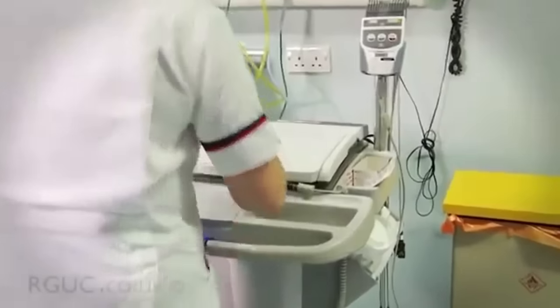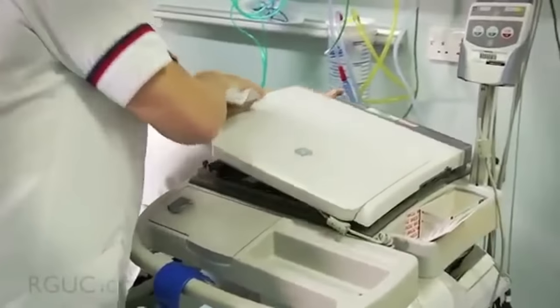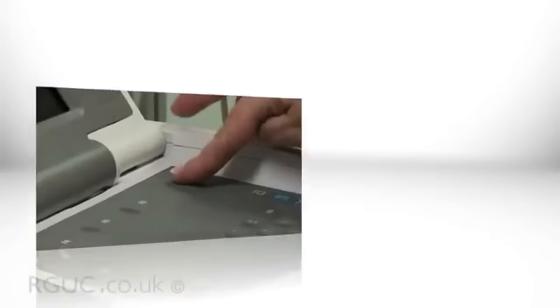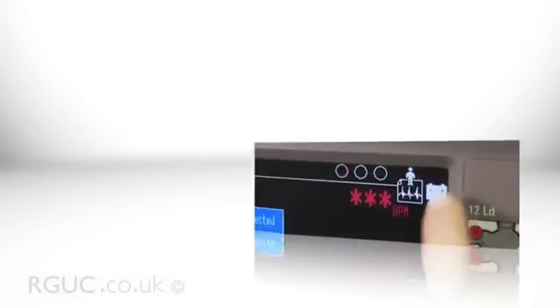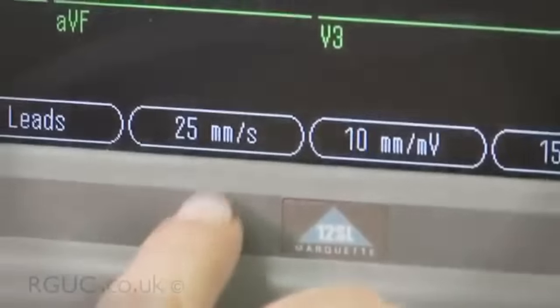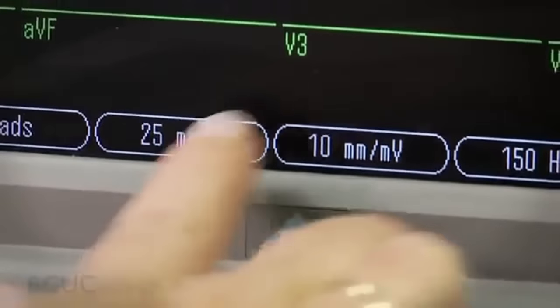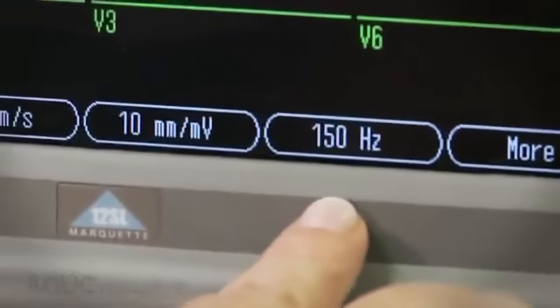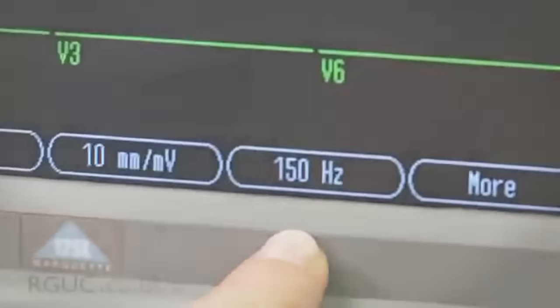You are now ready to prepare the items you'll be using. Place the ECG machine on the patient's left side. First, check that there is sufficient recording paper in the ECG machine, then turn it on. Check there is enough battery power and that the correct settings are selected: the paper speed at 25mm per second, the sensitivity or gain at 10mm per millivolt, and the frequency response, or filter, at 150 hertz.